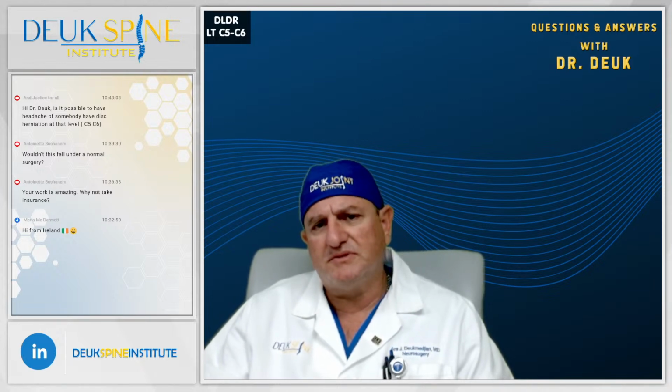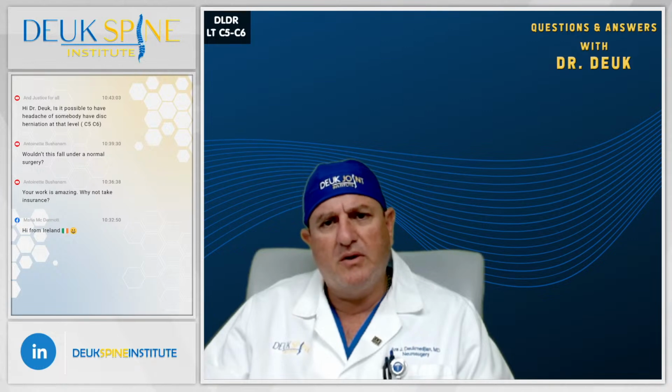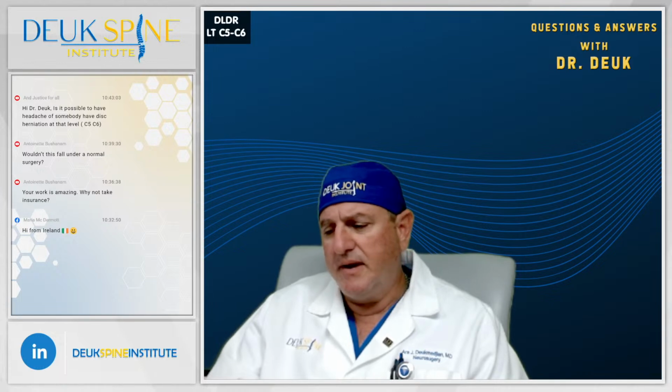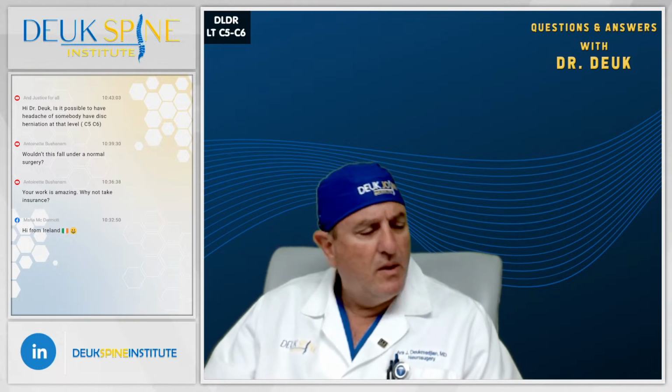That's exactly right. This is a very special dye that we use that only stains the nucleus pulposus. And it only stains degenerating nucleus pulposus, basically nucleus that's part of the herniation. So if it's not herniated, it won't stain it. If it's not degenerated, it won't stain it. But if it is, it will. Surgery went great. We were able to laser out all that material, and he's not going to have any more neck pain. I feel confident. He was having neck pain, I believe some headaches as well.